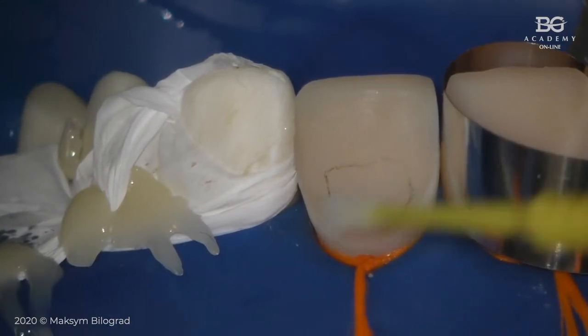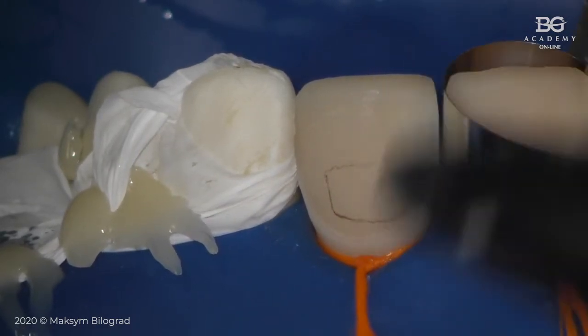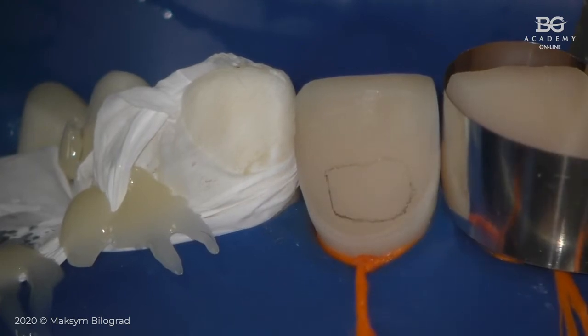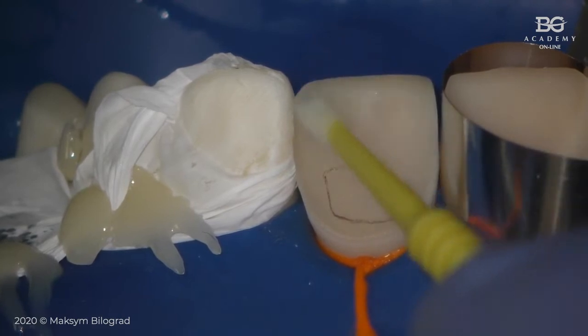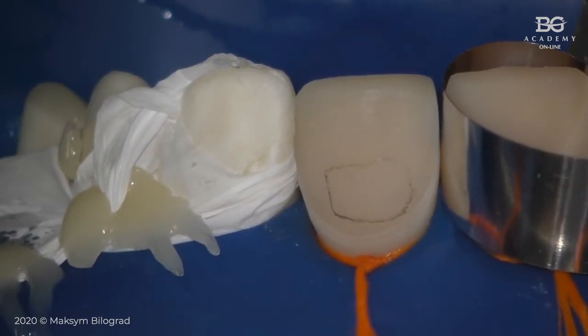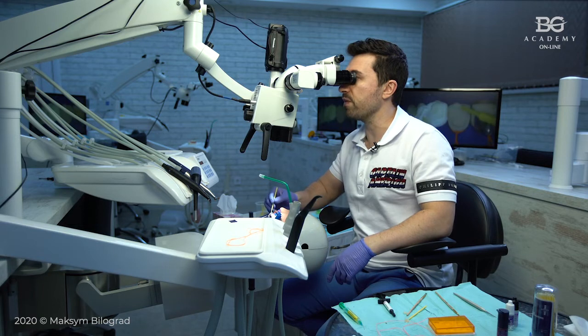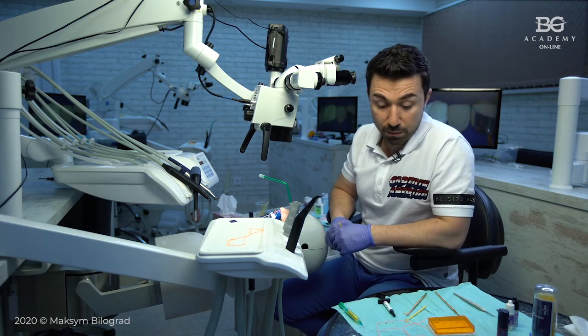You can use multi-coats of primer, by the way, and then you just dry it for 0. Just dry, and then you take second bottle, which is adhesive, and you put adhesive both on enamel and dentin. Okay, if you use 5th generation of adhesive system, which is still total etch, it's just one bottle system. In this case, you just apply from the very beginning to enamel and to the dentin at the same moment.